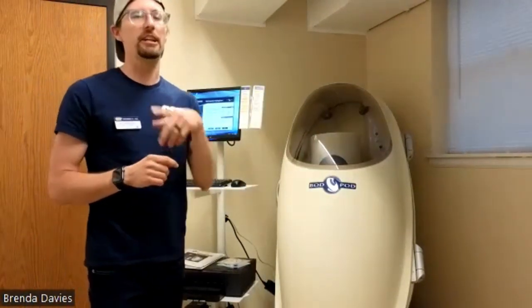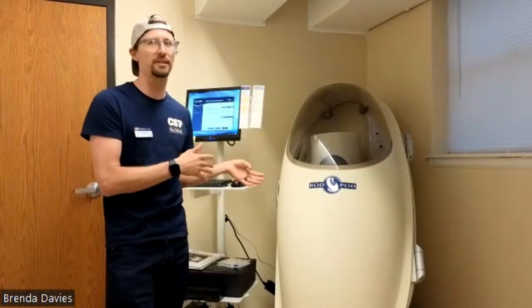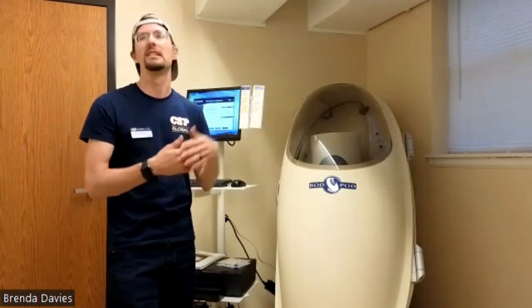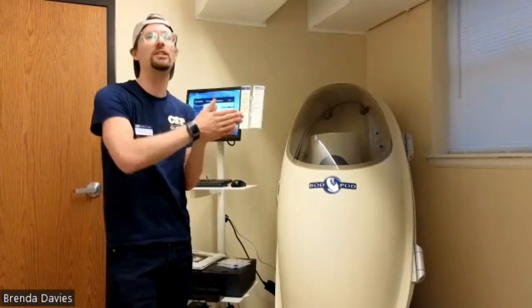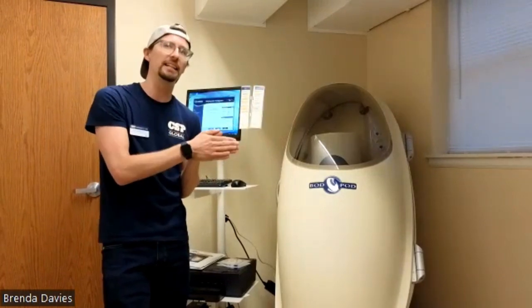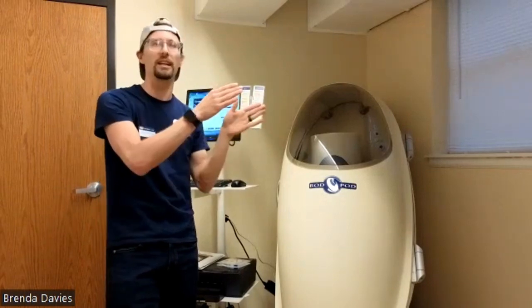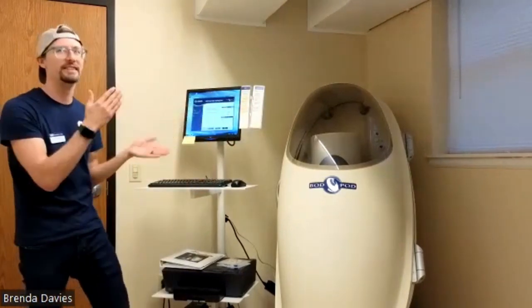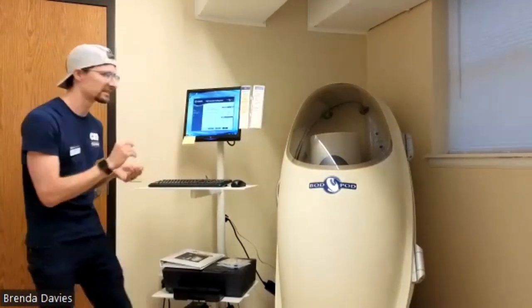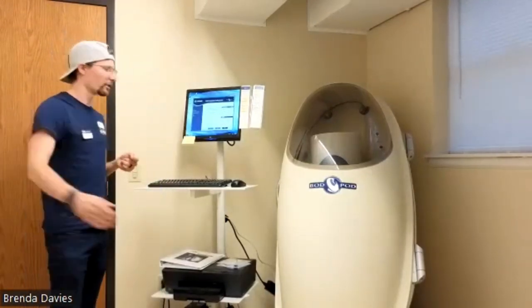Yep, and if you have a nose ring, we've had some times where people have newly pierced work where they can't take it out. If they just keep it in consistently, then you'll have consistent measures of changes in body composition, but the accuracy of that specific measure may be impacted. So bringing it over time, keeping it the same, it's fine, but the accuracy will be slightly off. Okay, so you look like you're okay to go on it.